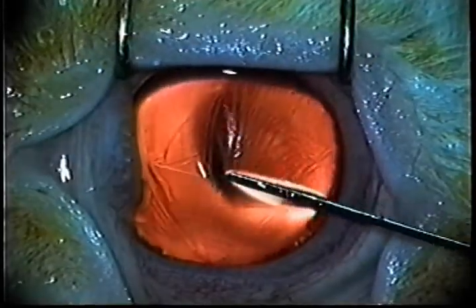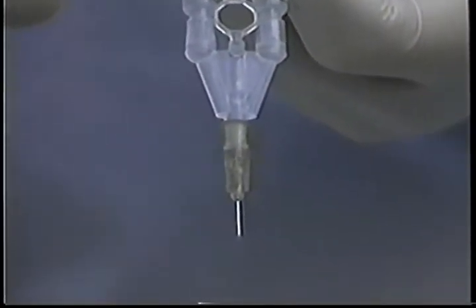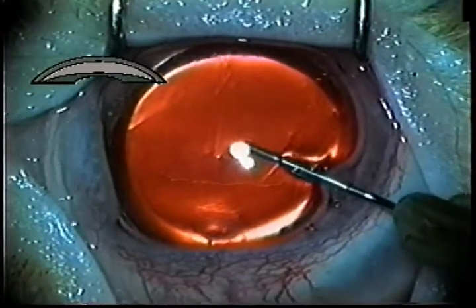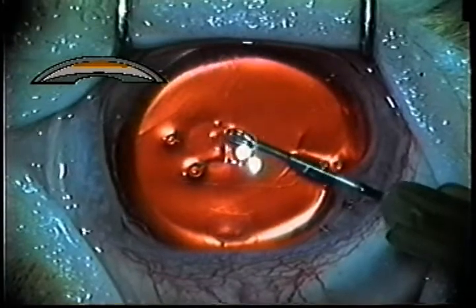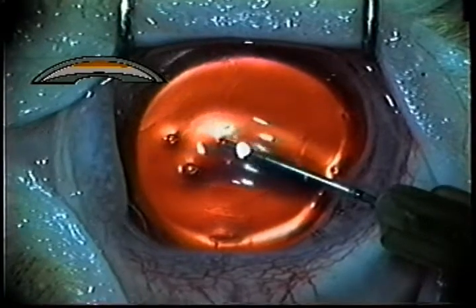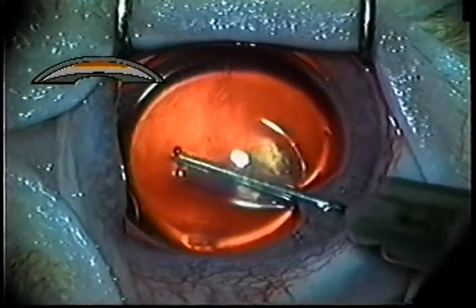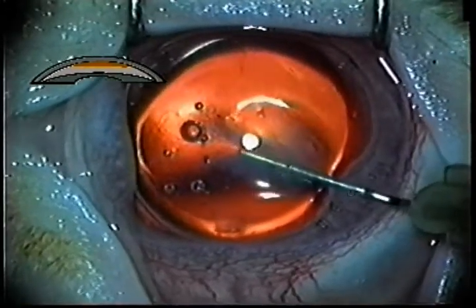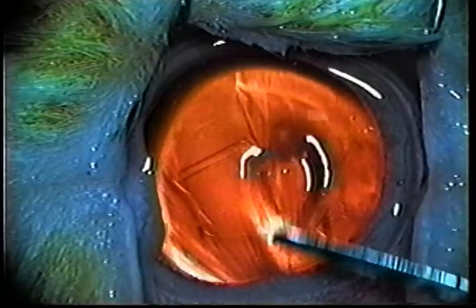In the glue Descemet's opexia, the glue should be applied between the air placed in the anterior chamber and the endothelium. This should be easy to do using my microdozer system, which releases the glue drop by drop. To cover all the detachment area, I had to do the application in two different times in eye 1. As the glue penetrates, it is pushed against the endothelium by the air, and coagulation occurs in seconds. I had to wait a few seconds before the second application so the first amount of glue would adhere firmly to the endothelium. It is great to see how the glue spreads slowly between the air and the endothelium without reaching the angle, keeping a distance from the iris and lens. In the second eye, with the paracentesis in a better position, I was able to cover the whole detached area all at once.